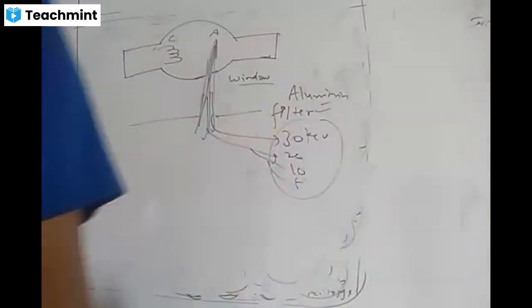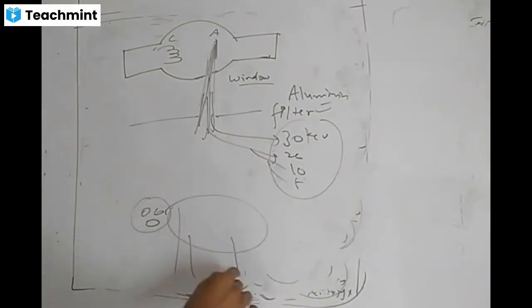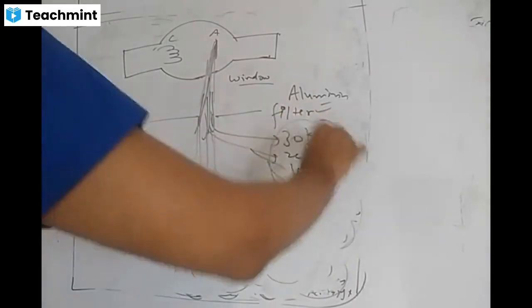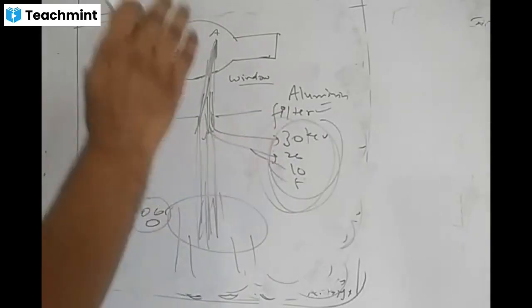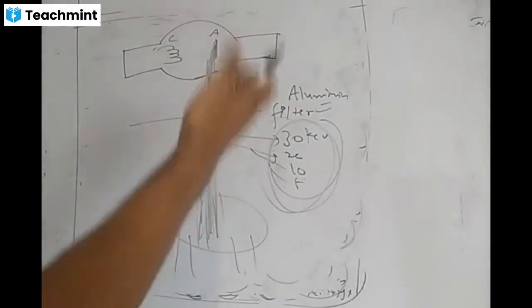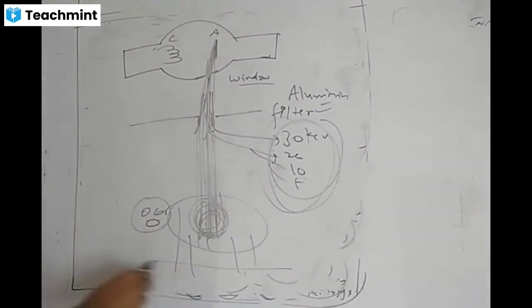That is the role of filters, so that the radiation reaching the animal body is able to penetrate. These low energy X-rays are unable to penetrate, and they just give exposure dose to the animal, which is of no use. So we want our X-ray beam to contain X-rays of high energy. High energy means they penetrate more, reach the X-ray film and produce the image.